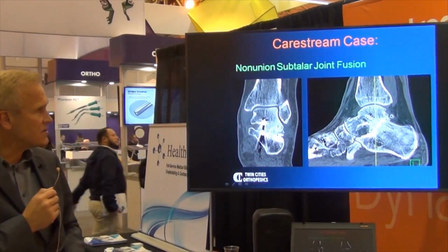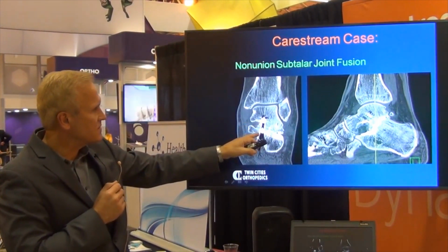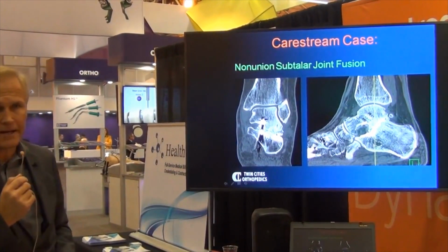So this is a patient I saw last fall. He had a previous attempt at a subtalar fusion, 2 screws placed from the heel up into the talar body.